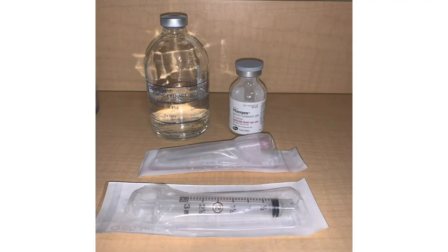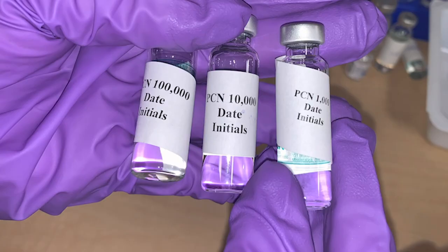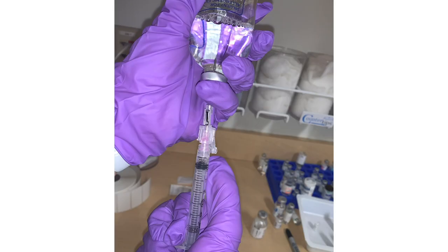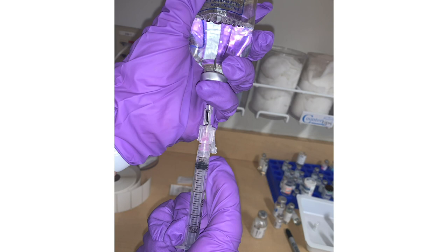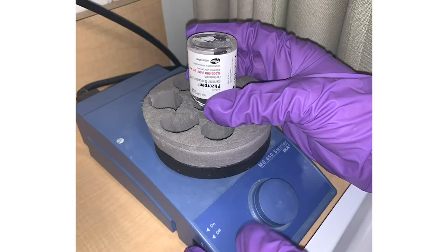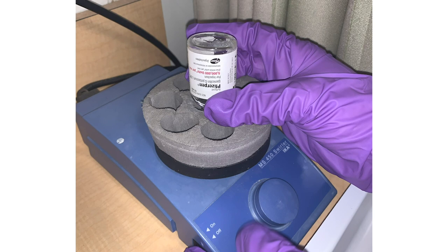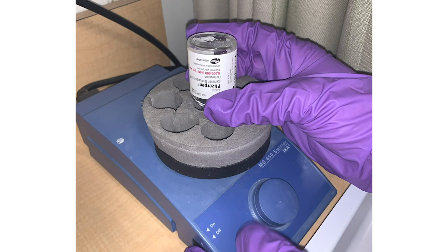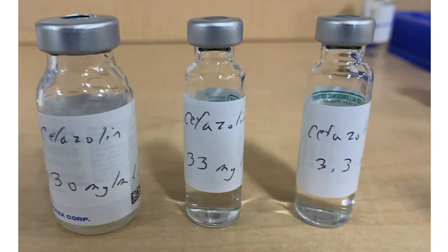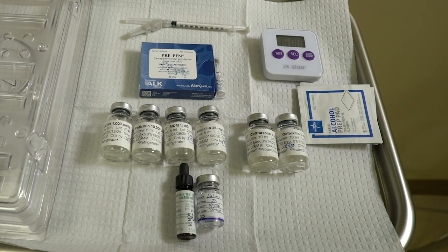If you are making dilutions within your own clinic, you must have a standard operating procedure to ensure complete accuracy. Dilutions are generally made at 1:10, 1:100, and 1:1000 concentrations. Materials needed for mixing and diluting include vials of sterile albumin and saline, and needles for mixing. An automatic mixer can be useful to ensure the drug is properly dissolved. Serial dilutions are performed in order to get the correct concentrations for skin testing.